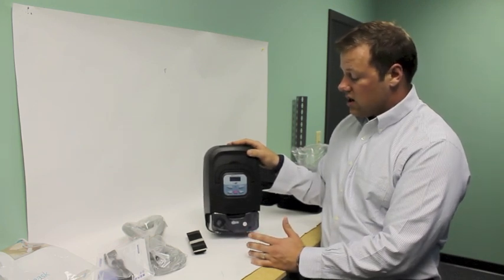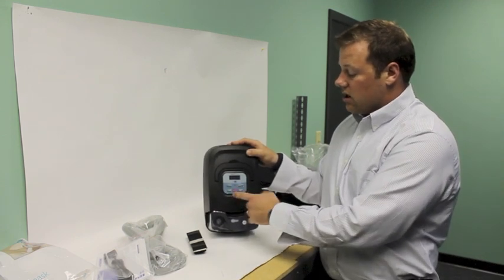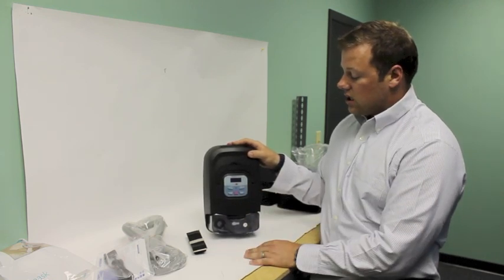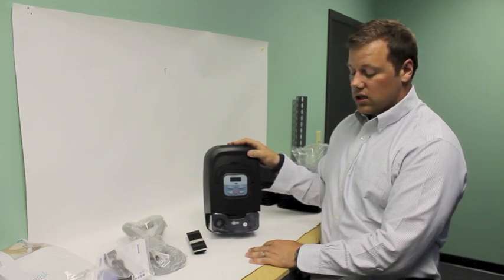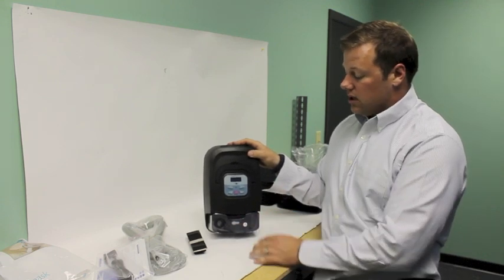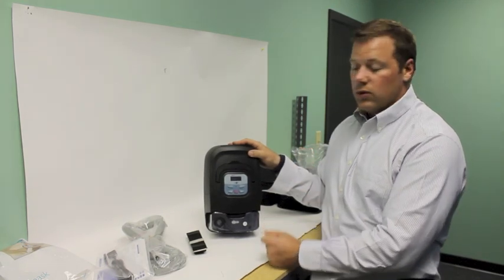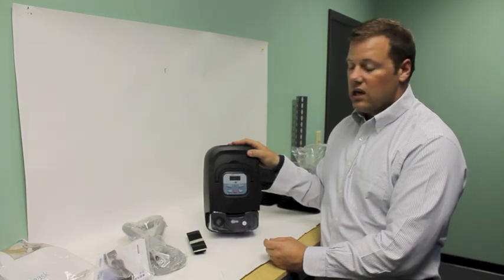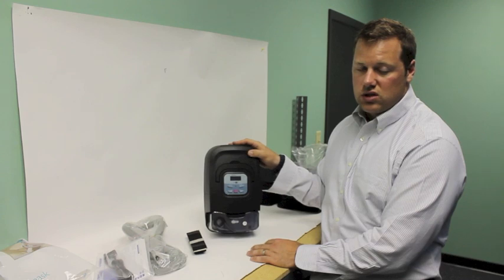So to turn this thing on, it's no different than all the other machines, just hitting the power button right there, on or off. As soon as you hit it on, it actually kicks on. It also has the auto start, which is just like the Philips and just like the RESmart. You have it all hooked up, the tube hooked up to your mask. You put the mask on, take a couple of deep breaths, the machine will auto sense it and turn on right away. Same if you take your mask off to go to the bathroom in the middle of the night, it senses that your mask is off with a high leak, and then it shuts off by itself.